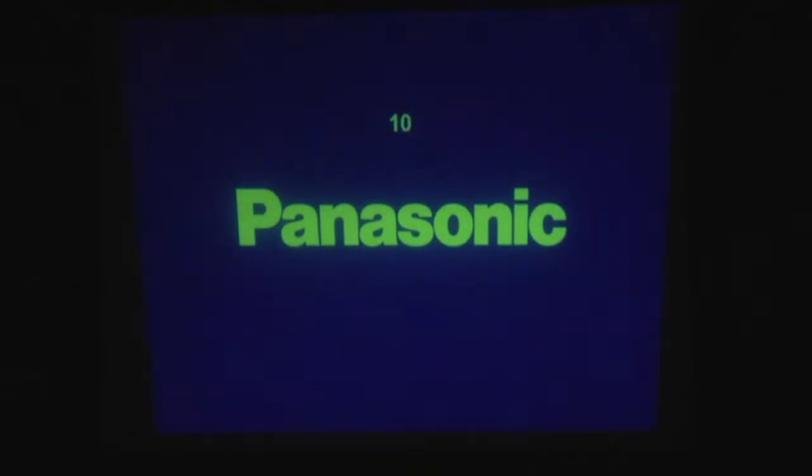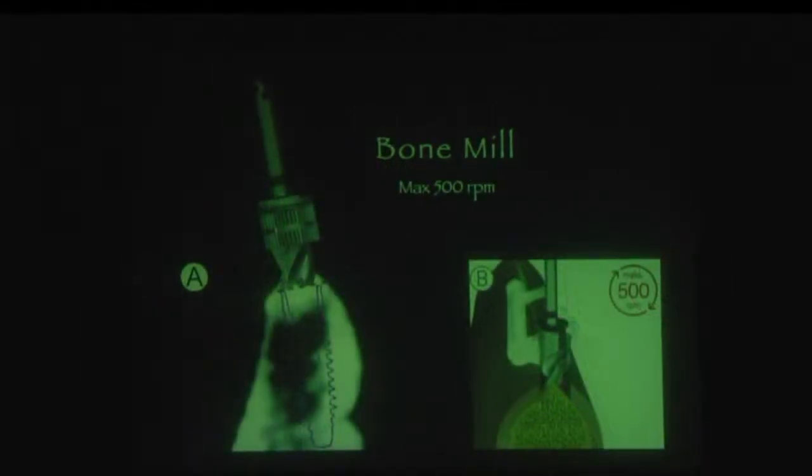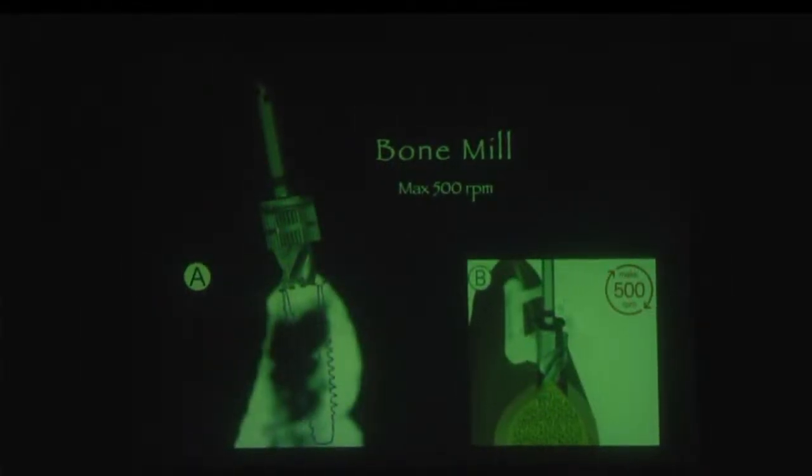So the last thing I was telling you about the bone-based implants, but in this procedure, no need to open, just make the excision, and after it, let's use the bone mill, and we go down and take it out, and the surface is ready to place the implant.